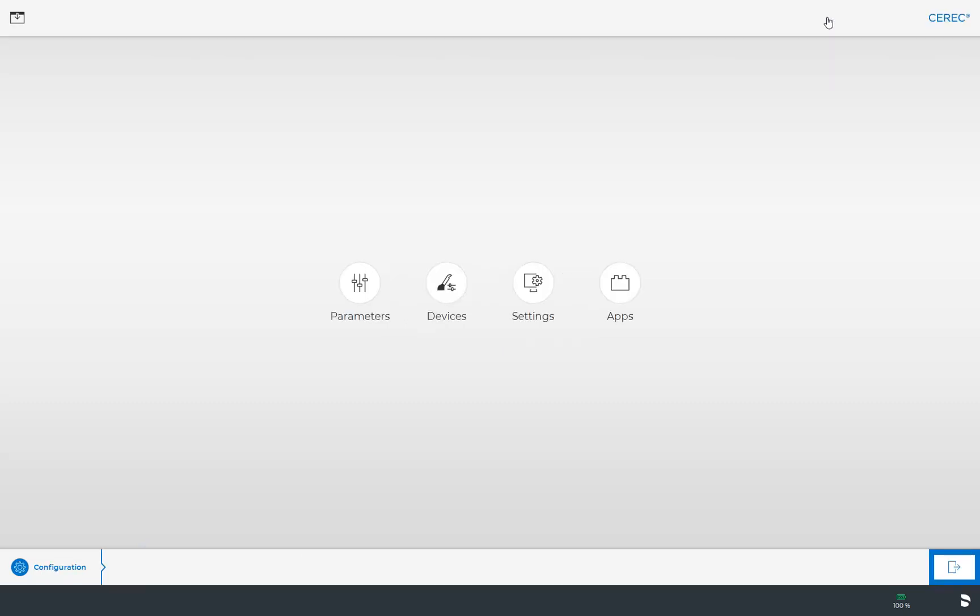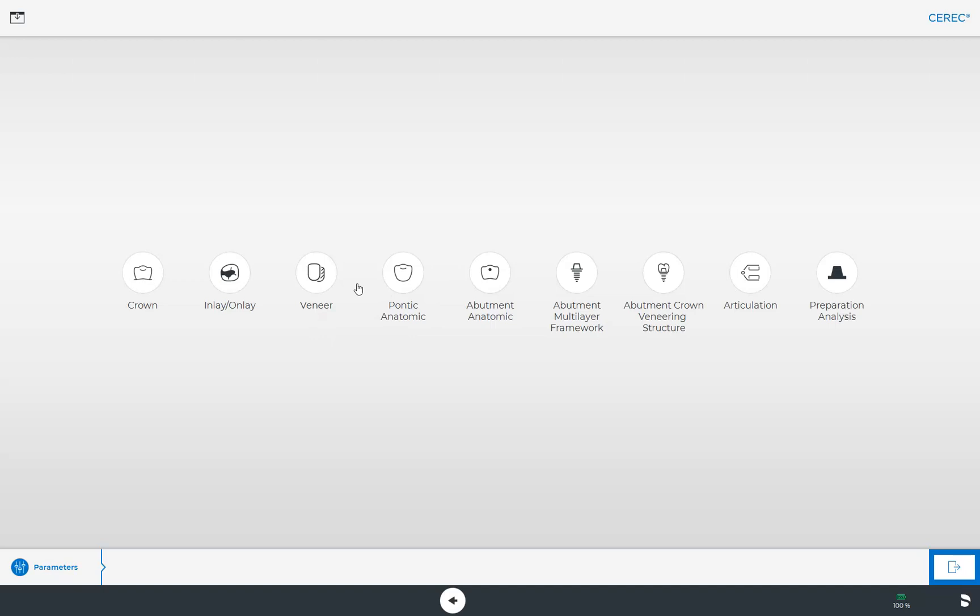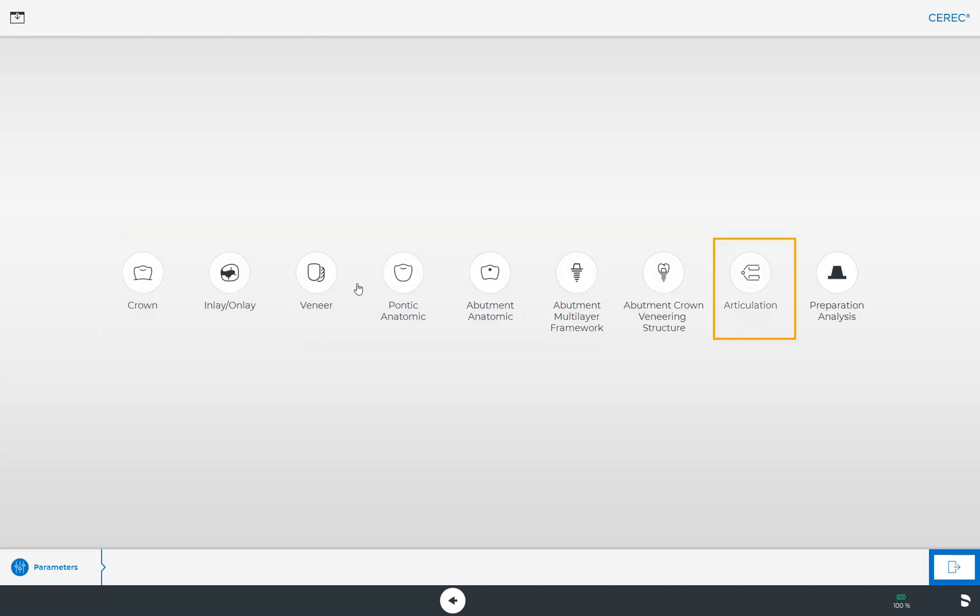The configuration menu in turn consists of four submenus which we will look at step by step. First we start with Parameters. This submenu is organized by restoration types, the articulator settings, and the preparation analysis.